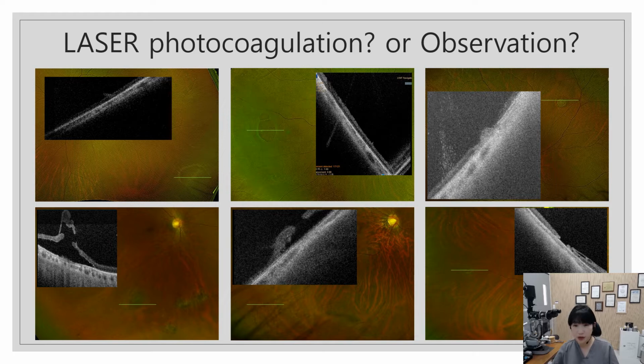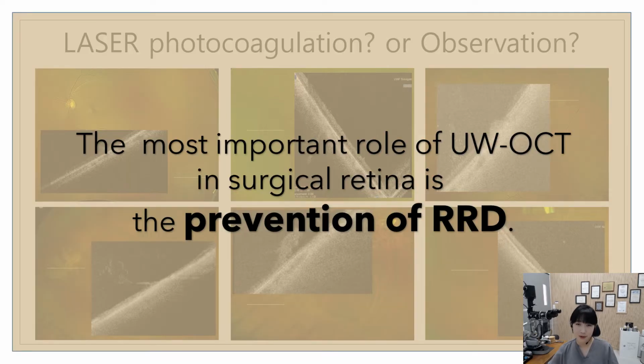This is especially useful for the eye doctors without vitreoretinal experiences, as it provides a clear base for a decision. So we need to say the most important role of ultrawide field OCT in surgical retina is the prevention of rhegmatogenous retinal detachment.